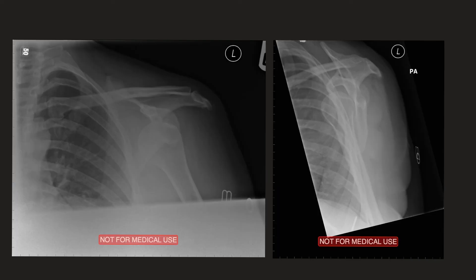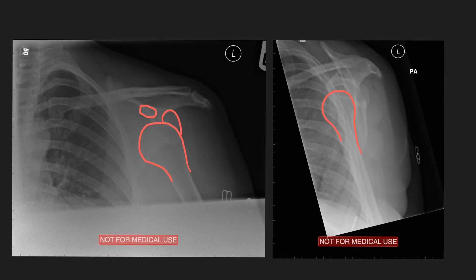On this first case you can see that the humeral head is not congruent with the glenoid. Instead it has moved inferiorly under the coracoid, which is in keeping with an anterior dislocation. Looking at the Y view, you can see that the humeral head is not overlying the Y shape of the scapula — it has been displaced and dislocated anteriorly.